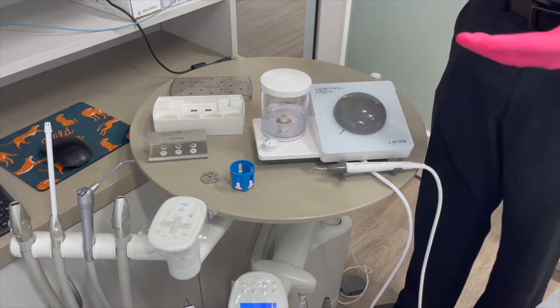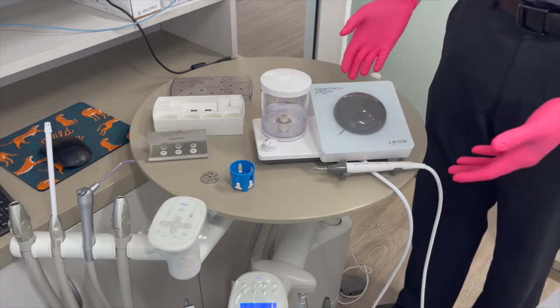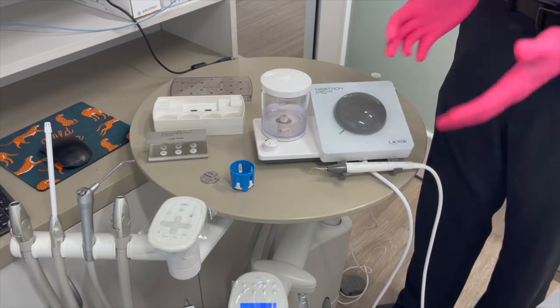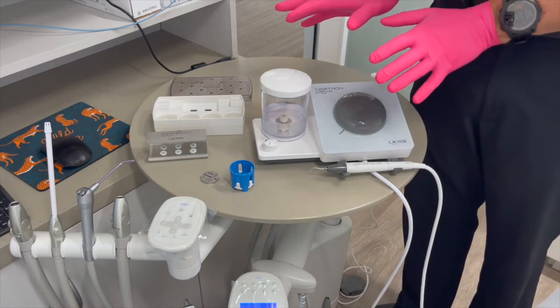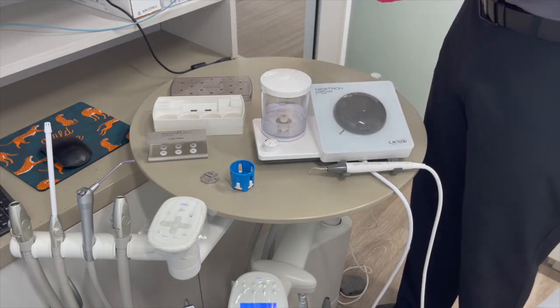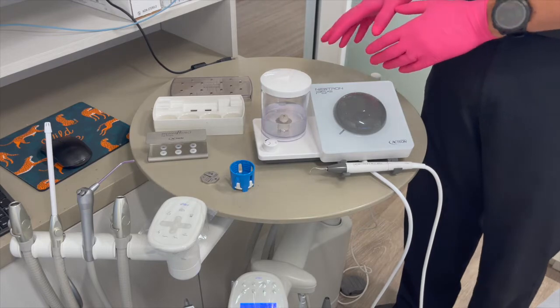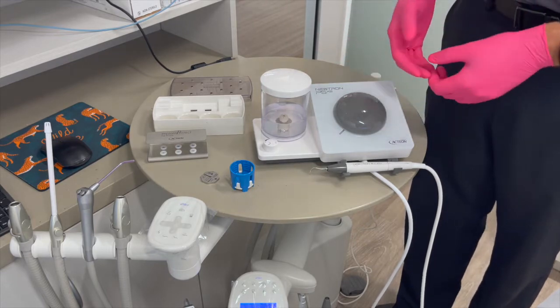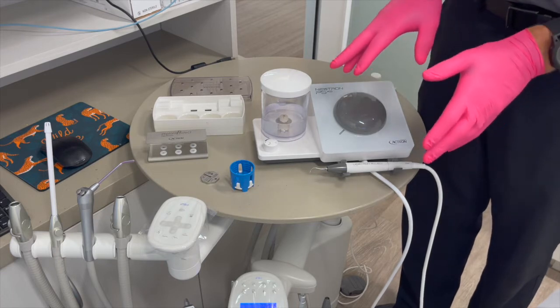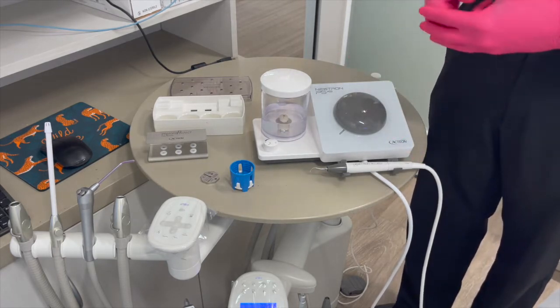Depending on the procedure you've just completed, you could have one or all of these items on your table chairside. Some of these items are going to be reprocessed here, and some are going to be brought to your sterilization area. Chairside, we would be disinfecting things that did not touch mucous membranes, and sterilization would handle anything that did come in contact with a mucous membrane.